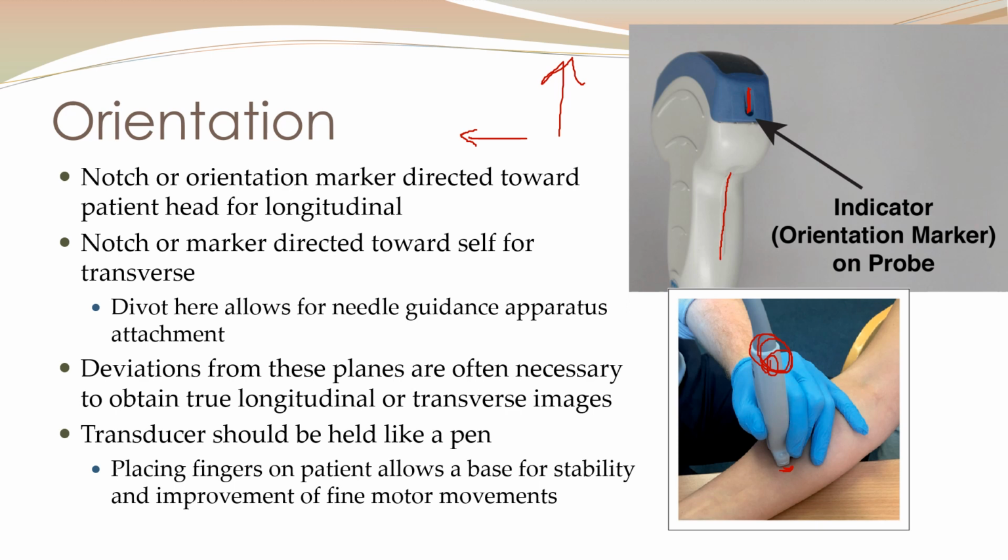The other thing you want to be careful of is not giving your transducer a death grip, which many of us, especially me, are guilty of. My right forearm is about 1 inch to 2 inches larger than my left forearm, because I would hold on to that transducer so tight. So be aware that you have to have a good grip. Sometimes gloves help. There are also ergonomic devices that can add a little bit of friction here to help you with your grip and things like that. So those are things you can look into if you're having any issues this way.